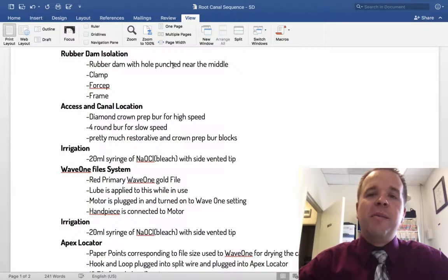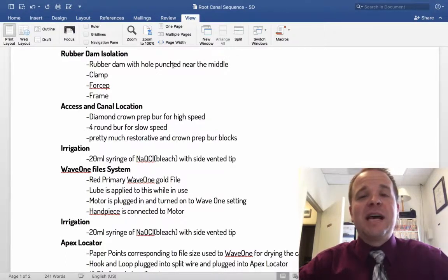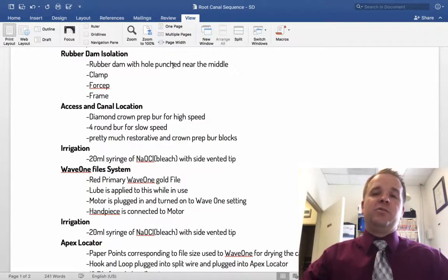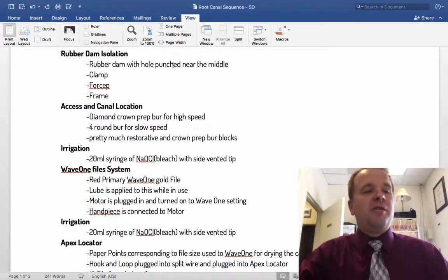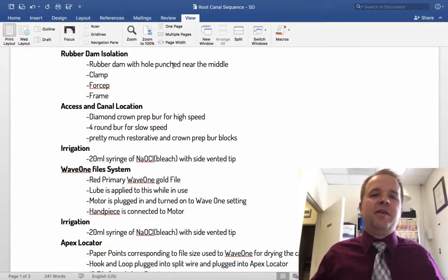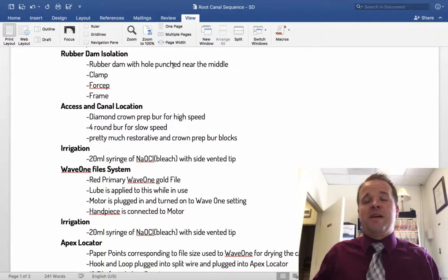Once they're numb and once they've consented to the root canal treatment, then you're going to put a rubber dam on their tooth. This is going to help make sure that everything stays isolated because you're going to be using essentially bleach in their teeth to kill all the bacteria and all the bad germs that are in there. I don't know the last time you drank bleach, but you don't want anybody to have to do that. So we do a rubber dam to make sure that no one ever tastes that bleach at all. So you put that in there, and also the infection doesn't taste very good.